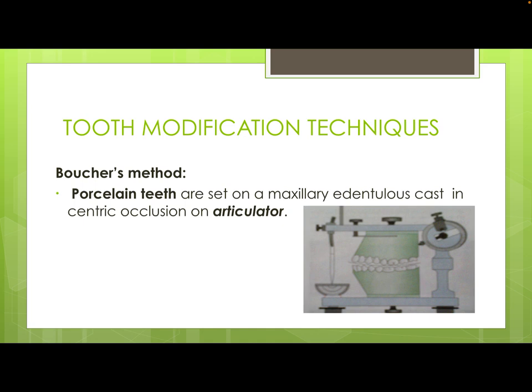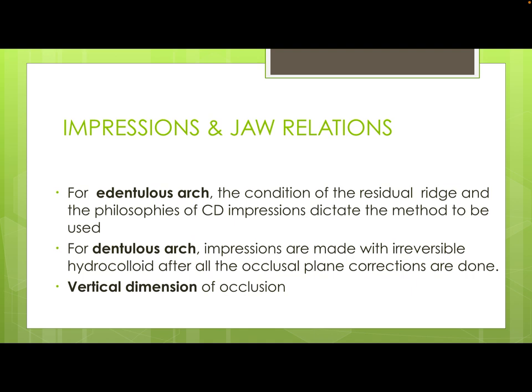The last technique is the Boucher's method. In this method, similarly the centric relation is recorded using the occlusal rim, and porcelain teeth are used instead of acrylic teeth. Since porcelain teeth are harder, they will help to grind the natural tooth and bring it into occlusion.